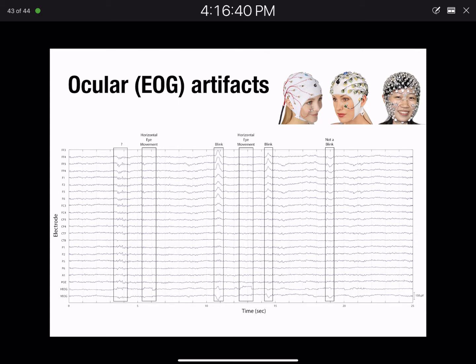And when it detects an eye movement, it'll mark the trial as bad in the EEG study and tell the stimulus program to add another trial to the experiment so that you're sure that you get the target number of trials. Because for any ones where they move their eyes, even though post hoc, as we'll talk about in the lab and mentioned in the chapter, there are ways of removing these eye movements or correcting for them, if the point of the experiment was you're supposed to be looking there, as soon as they look over, it doesn't really matter that you can correct for that eye movement. They're not looking at the right thing. And so from a conceptual point of view, the assumptions of the experiment are not being held. And so marking those trials online and being able to replace them is really valuable.